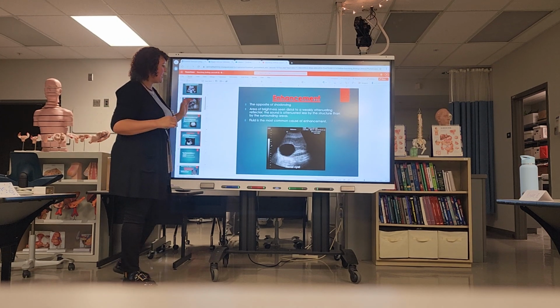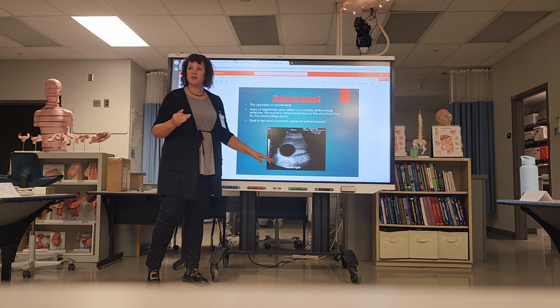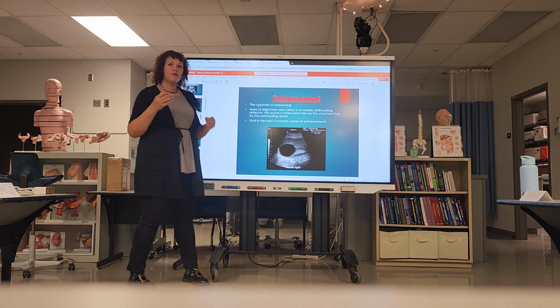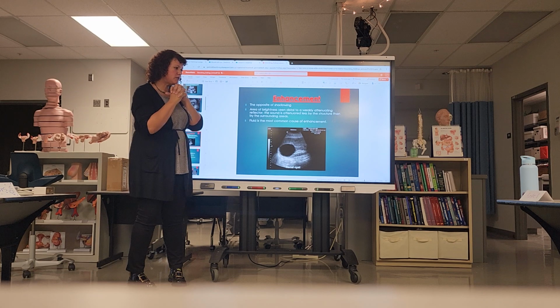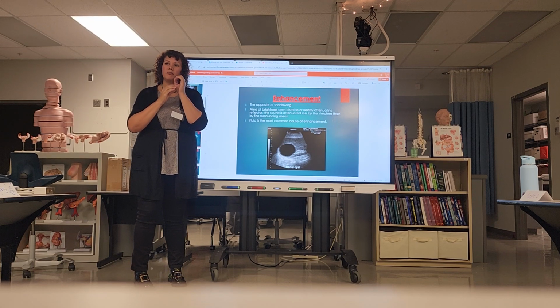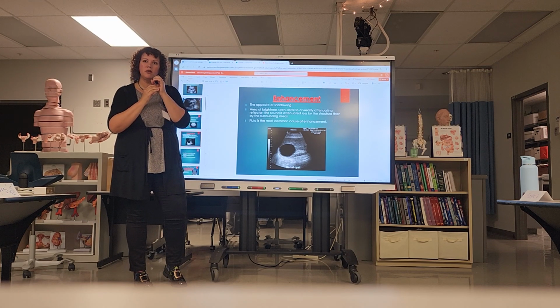We also have enhancement, and enhancement really helps us with cysts. Does everybody know what a cyst is? If you don't know, it's just a pocket of fluid. Sometimes we come across pathology and it's hard to differentiate whether it's something solid but very hypoechoic, or a pocket of fluid.